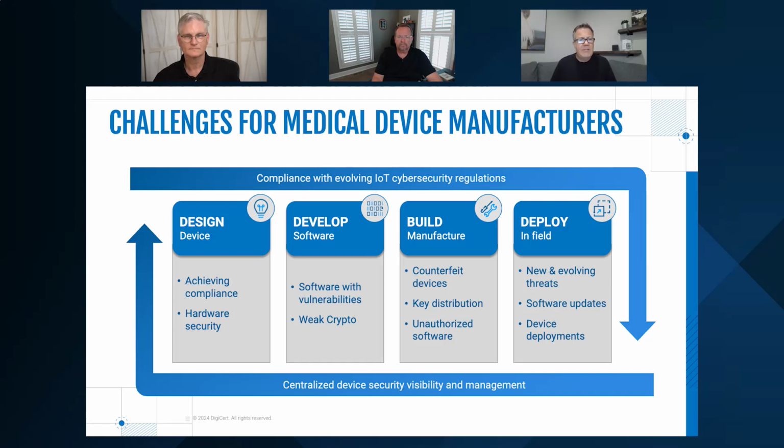And they've had a lot of challenges with vulnerabilities in crypto and new crypto standards coming out from NIST to combat post quantum computing. And so, in the develop phase, they've got a lot of challenges that they've had to think through because of these extended lifespans, right? So their medical devices may be sitting in the supply chain for 2 or 3 years and may come up in a world where post quantum computers have now broken classical algorithms.